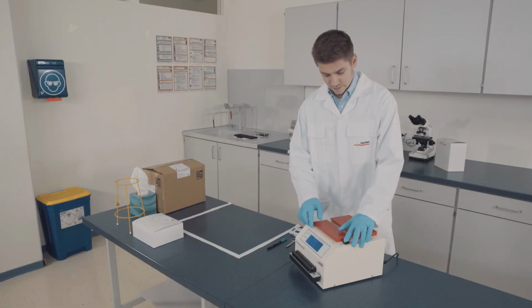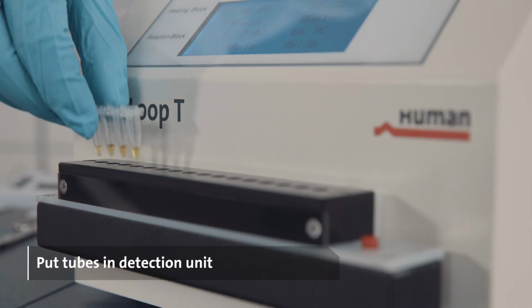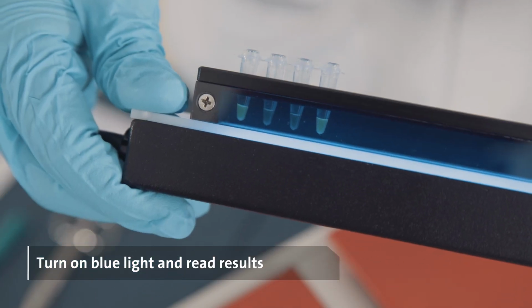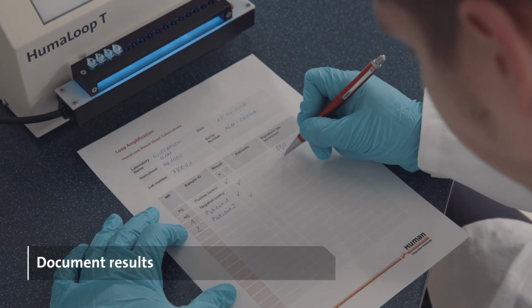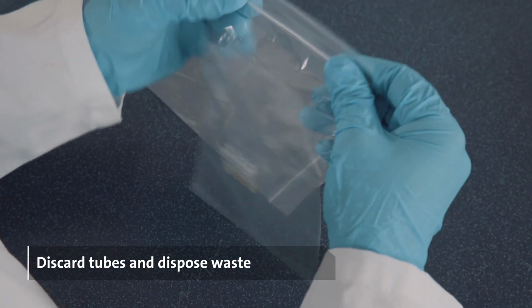After the completed LAMP reaction, put the tubes in the fluorescence detection unit and turn on the UV light to read the results. The positive samples will now fluoresce green. You can double-check your results with the control samples. Document your results. Discard the reaction tubes and dispose the waste in accordance with your local regulations.